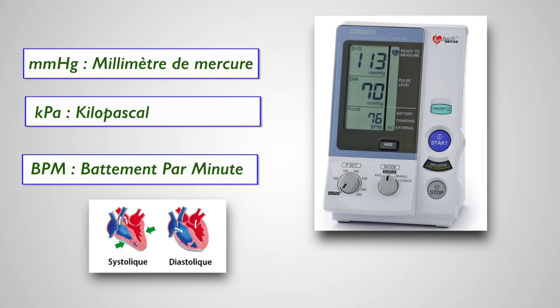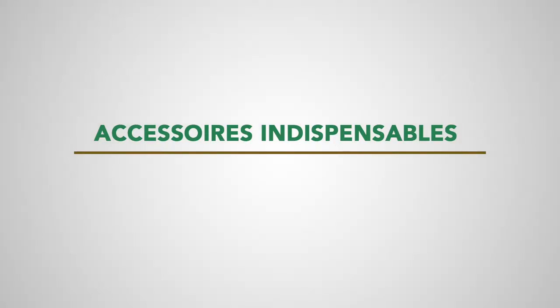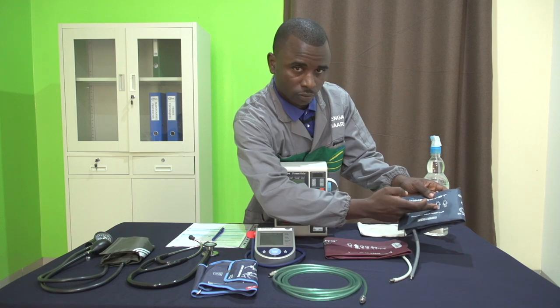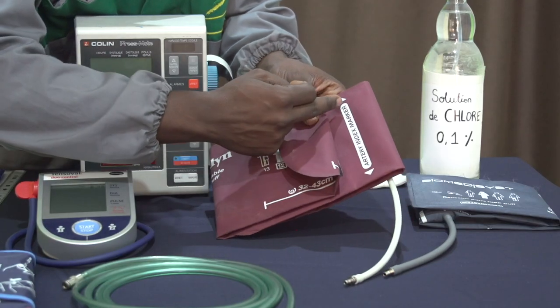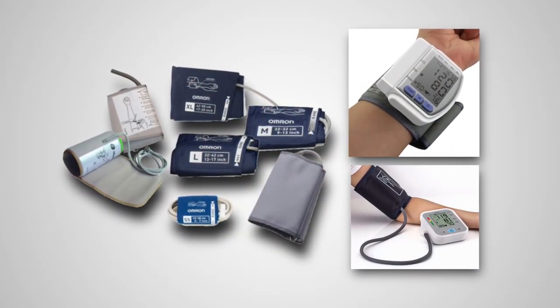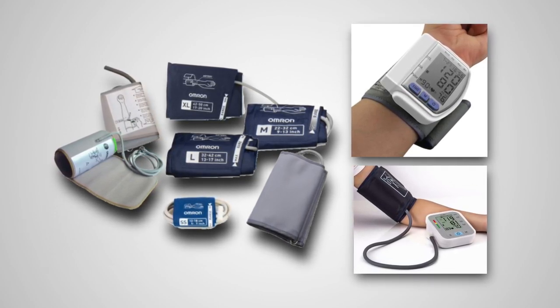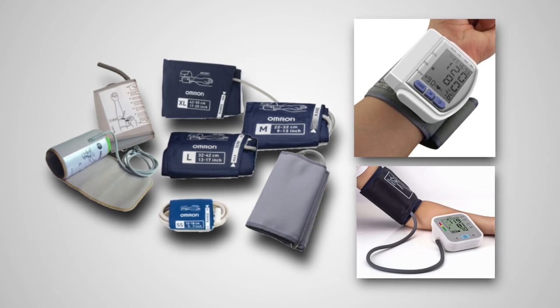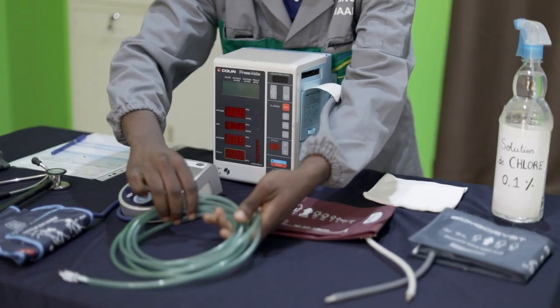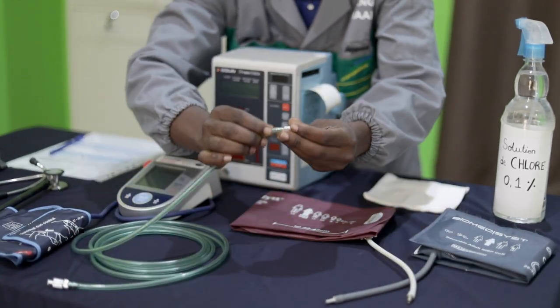Les pressions sont généralement mesurées en millimètres de mercure ou en kilopascals, et le pouls en battements par minute. Il est important d'avoir un brassard adapté à la corpulence du bras du patient et de placer la ligne marquée sur chaque brassard au niveau de l'artère humérale. Il y a une surestimation des valeurs quand le brassard est trop petit et une sous-estimation quand il est trop grand. Le prolongateur doit être étanche et peut être spécifique à l'appareil.